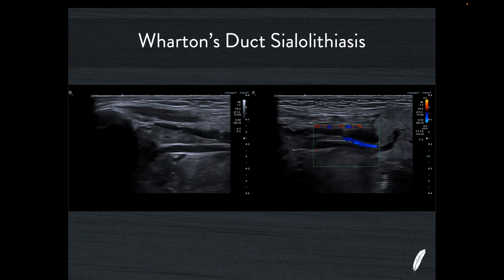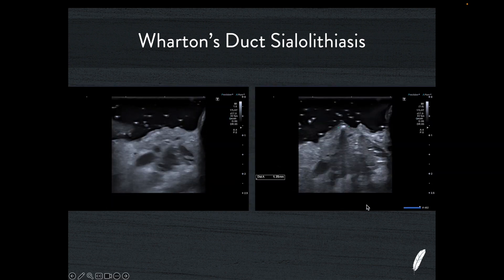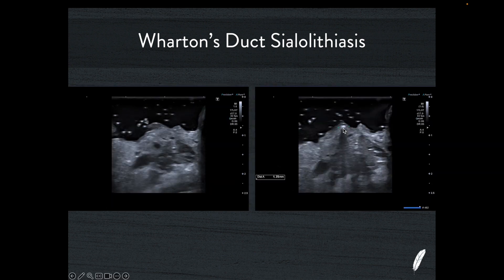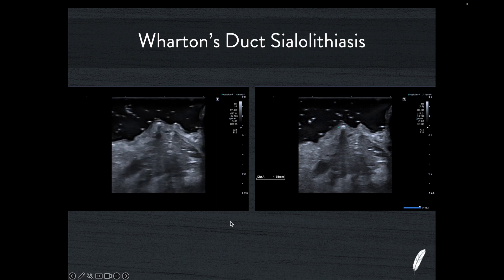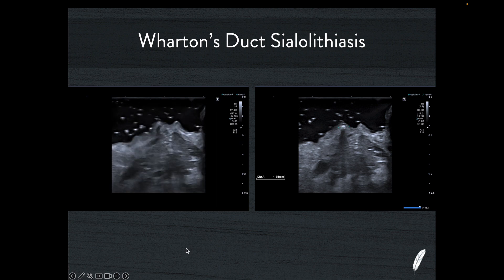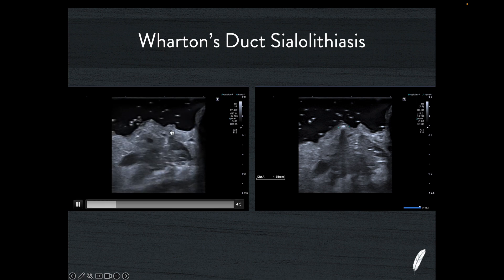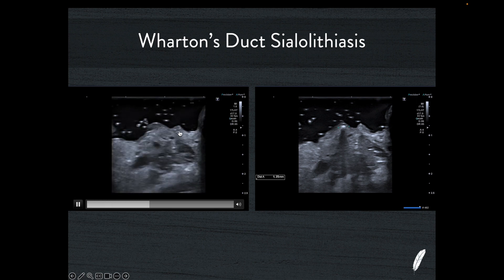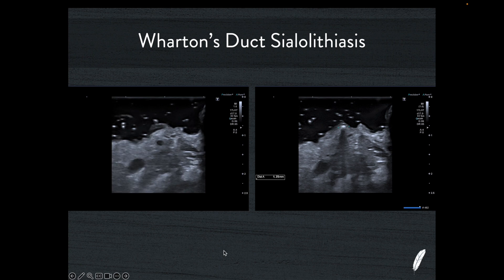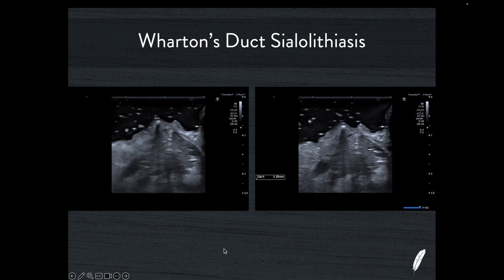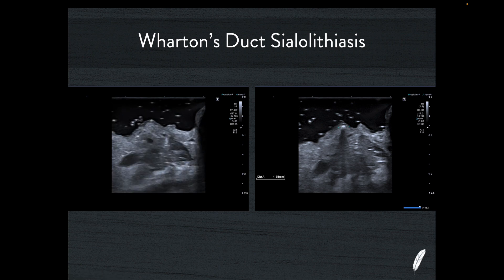So once again we do our little trick and go inside the mouth — and bingo, you can see the little obstructive calculus sitting right at the ampulla of the right-hand-side Wharton's duct. The left-hand-side ampulla has no obstruction, no calculus sitting in it. This is the answer — very much akin to a vesico-ureteric junction stone in the renal tract system.